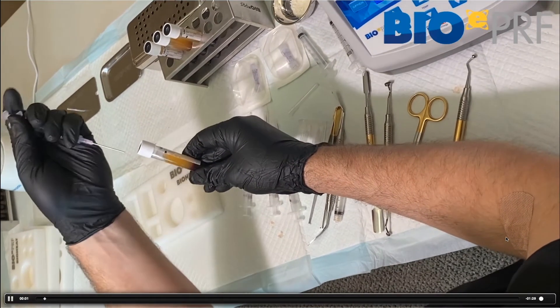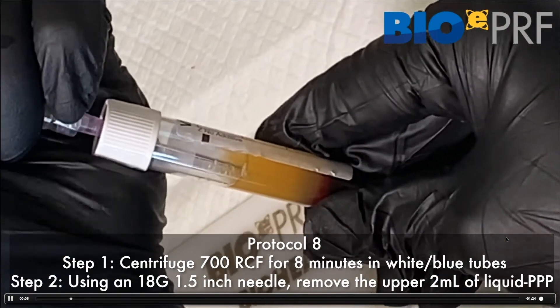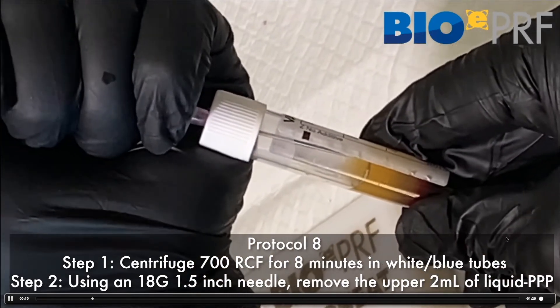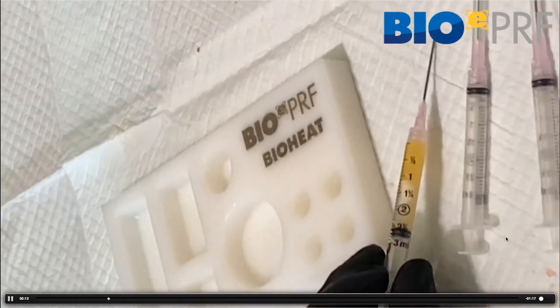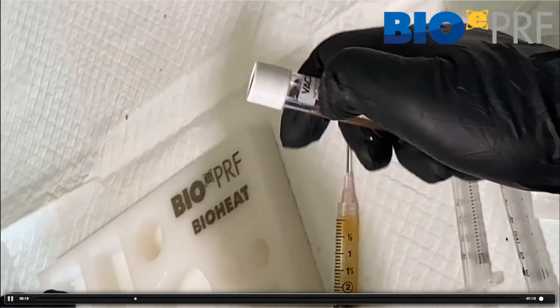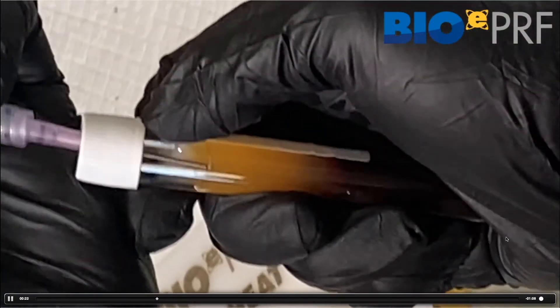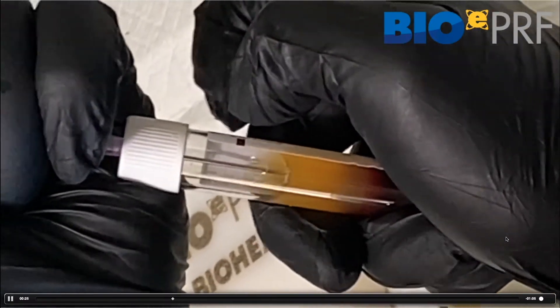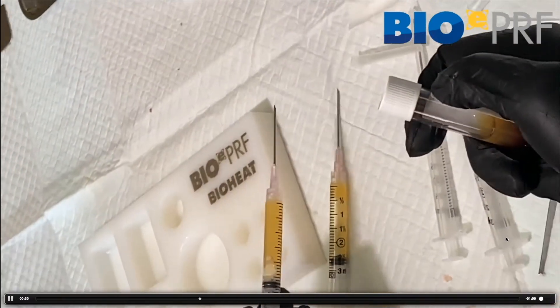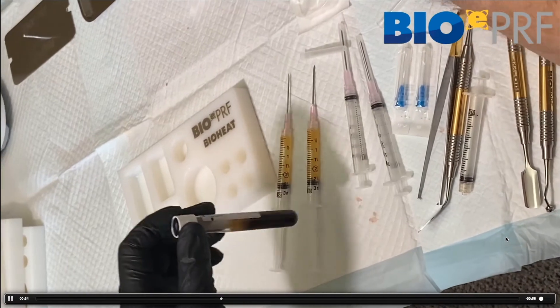Let's go over the protocol. The first step is drawing the upper 1.5 to 2 mLs of this liquid from the tube — that's about 1.5 to 2 cc's. We're going to do two tubes here, so we're going to do two bio heat treatments. We draw this up and then place it into the bio heat device.